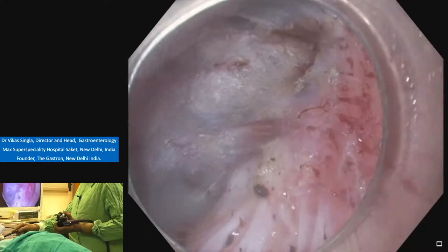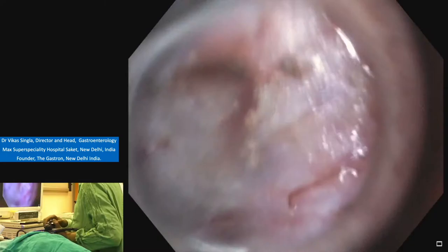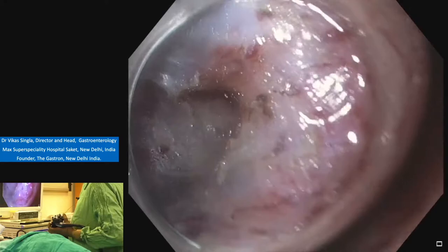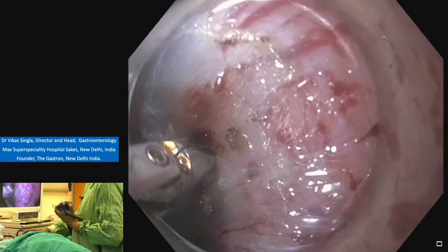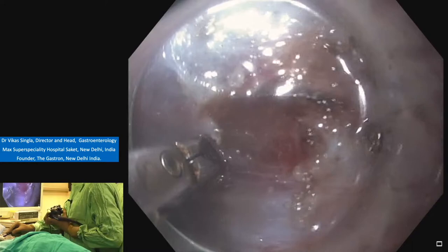I think we are done with the tunneling part. There are some wounds there. We have to free the vessel and maybe some tiny vessel there, which is bleeding. This seems to be a very tiny vessel. We can use the tip of the coagulator also. Okay, one more vessel there, again coagulated. I think there is no active bleed there.